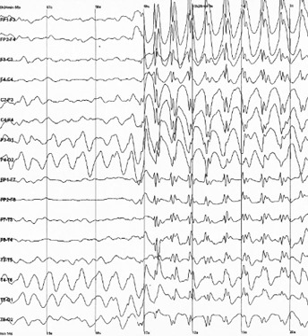EEG does not involve exposure to high-intensity, greater than 1 Tesla, magnetic fields, as in some of the other techniques, especially MRI and MRS. These can cause a variety of undesirable issues with the data, and also prohibit use of these techniques with participants that have metal implants in their body, such as metal-containing pacemakers. EEG does not involve exposure to radioligands, unlike positron emission tomography. ERP studies can be conducted with relatively simple paradigms, compared with, e.g., block design fMRI studies.